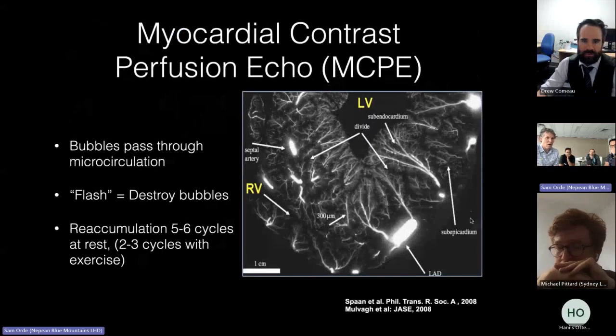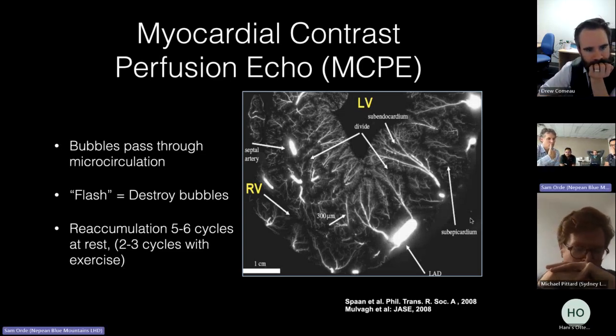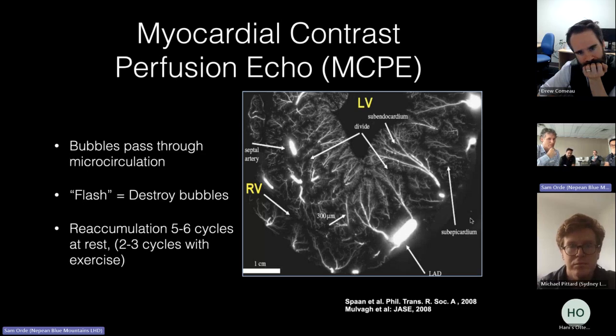So what we did next with this guy is to try and make an assessment of how his blood flow is. When they do angios and they're opening up these areas, the way that some of the cardiologists, and Santosh, describe it to me is he says that we often trash the microcirculation. What he means by that is as you put in a balloon and inflate up a blood clot, you can break up part of that clot and it goes downstream and breaks up into smaller bundles. Some of it gets trapped by the scaffolding of the stent, but you do send a whole bunch of blood clots distally, and that means that you can destroy some of the microcirculation, right?